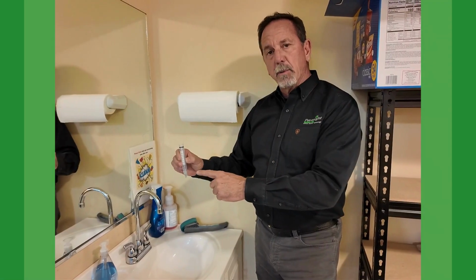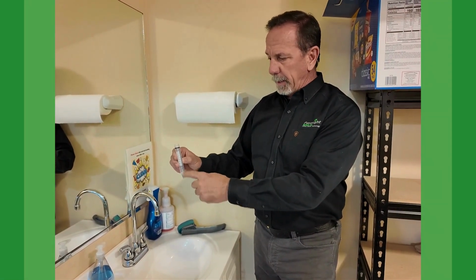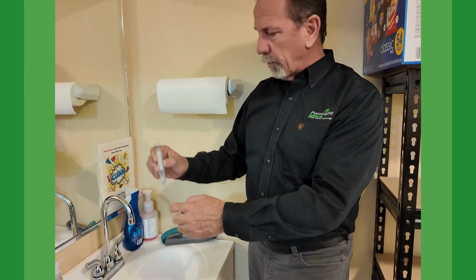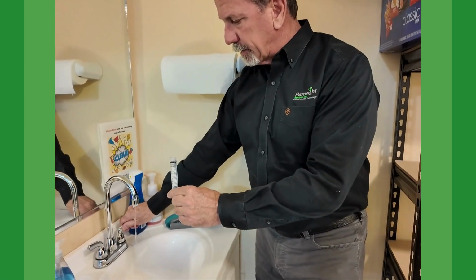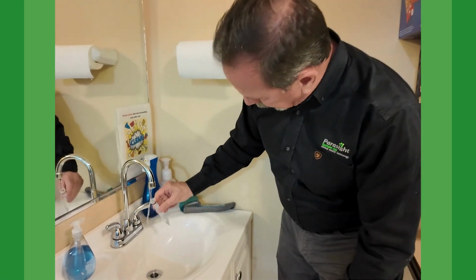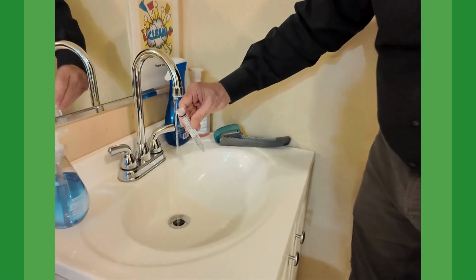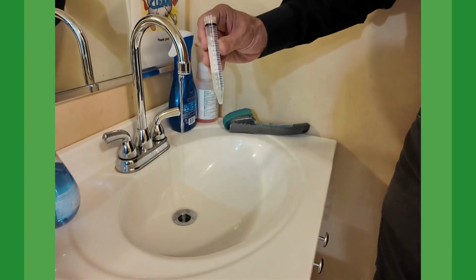So now I'm going to simulate what you'd normally do. There'd normally be the little plug sample, the mucus sample on the bottom there. And we're just going to add regular tap water to about 10 cc. So we add that to the top 10 cc's here. I'm going to get close to that. It does not have to be perfect.